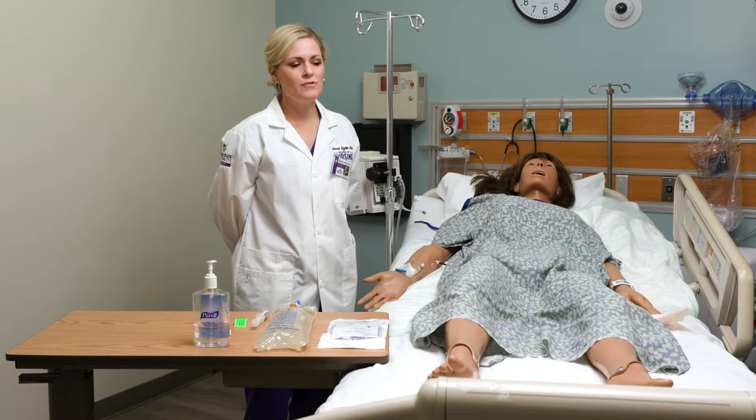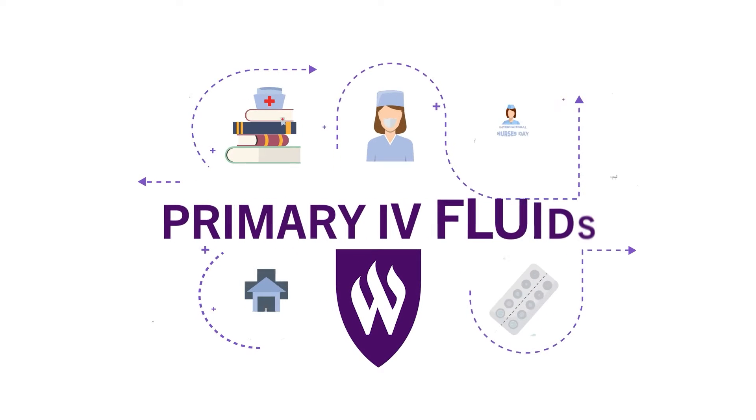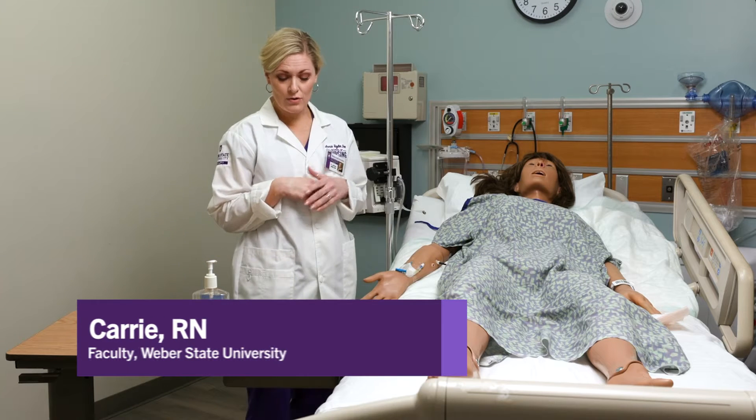I'm going to show you how to hang primary IV fluids. First, I'm going to gather my supplies before I go in the room.